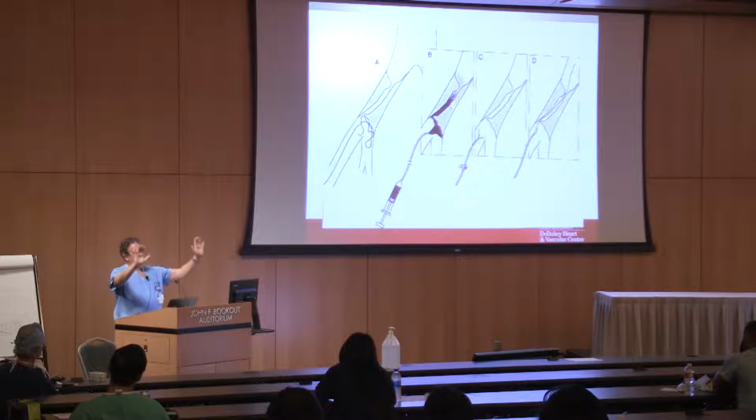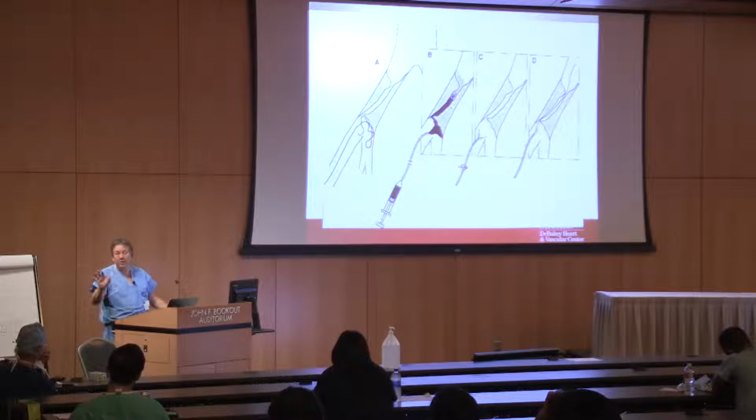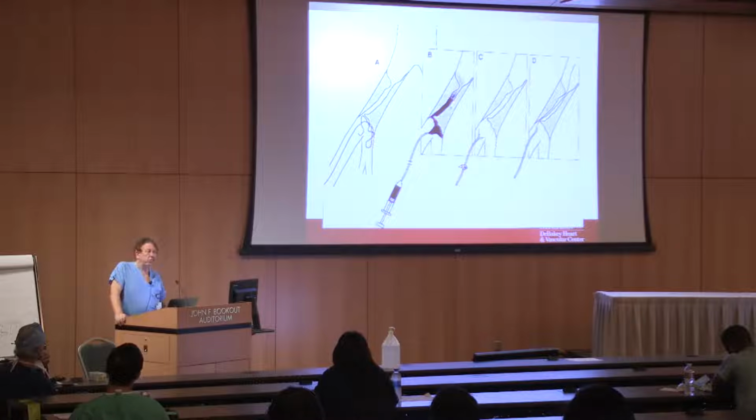And typically the way it's set up is you have an overlay on the left screen, and we have a completely live image on the right screen. So we're not really fading it up as much. Once you get used to checking off left screen to right screen, a lot of people completely forget about the fact that the right screen is just a straight fluoro image. And these are things that you will learn. Okay, so digital subtraction angiography is one of the things you can do.